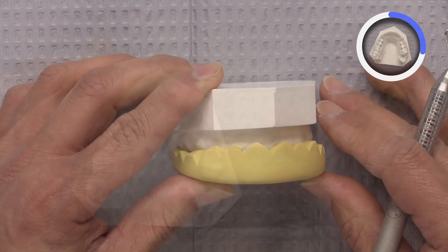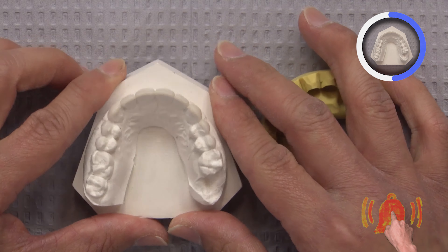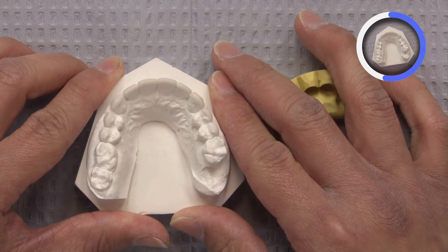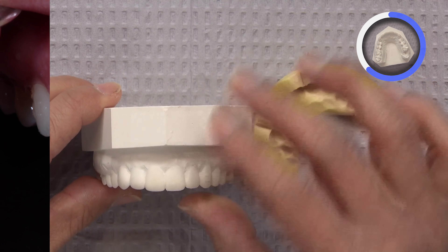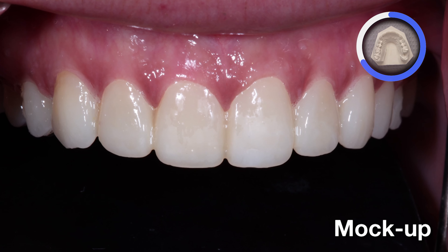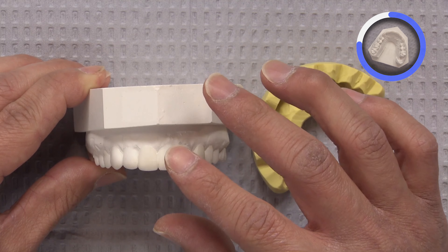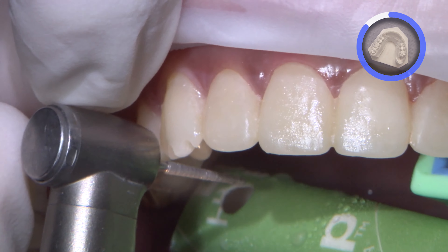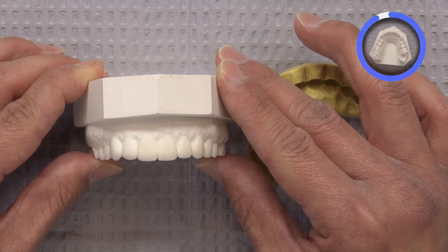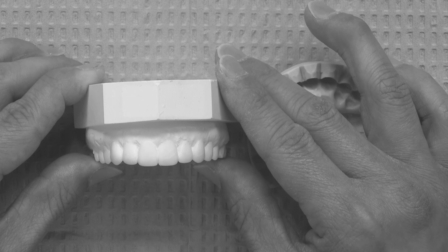After the patient's approval with the mock-up, and once we know our limitations and where we're going with the case, I will apply the acrylic mock-up on the patient and prep directly through the mock-up. Prepping through the mock-up is one of the best ways to guide yourself on where tooth structure needs to be removed and where you may not need to remove as much material. I highly recommend having a diagnostic wax-up for all of your aesthetic cases.